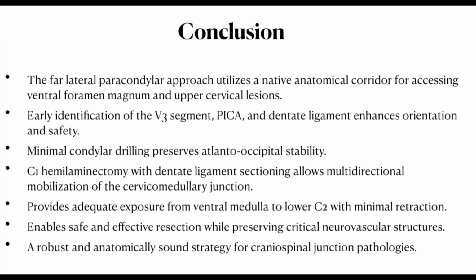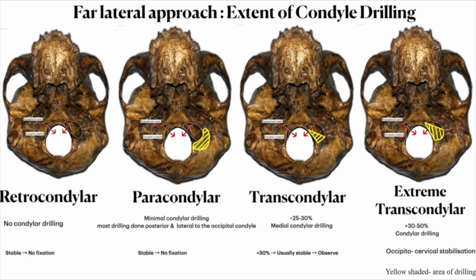These maneuvers facilitate multidirectional access to the ventrolateral brainstem and upper cervical cord, enabling gross total resection while preserving the integrity of lower cranial nerves, vertebrobasilar vasculature, and maintaining atlanto-occipital stability. Beyond the paracondylar approach demonstrated, the far-lateral approach includes several tailored variants.